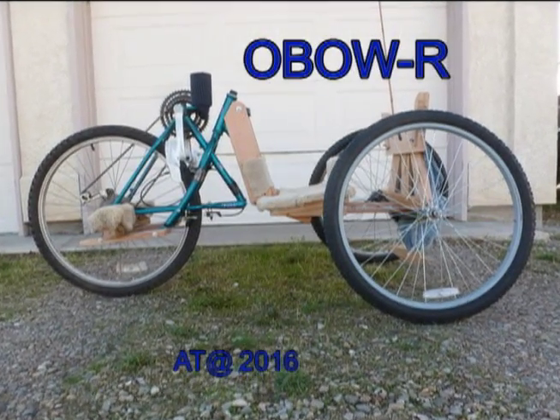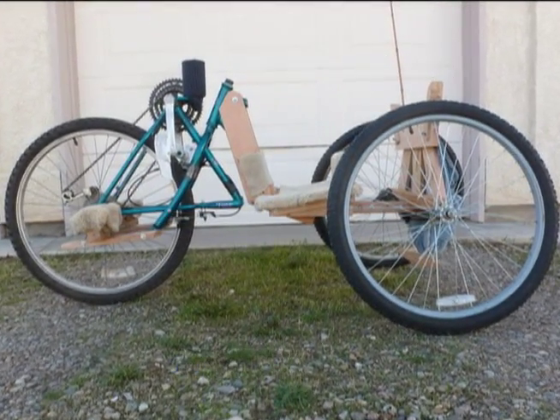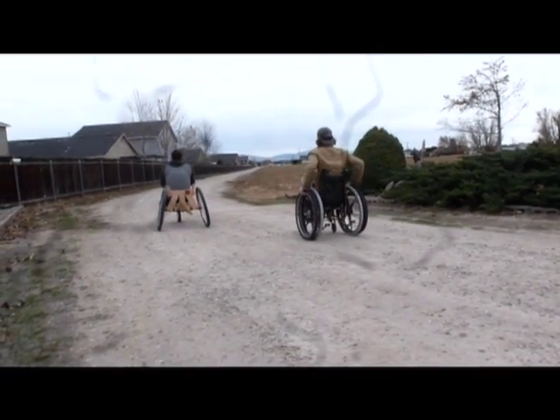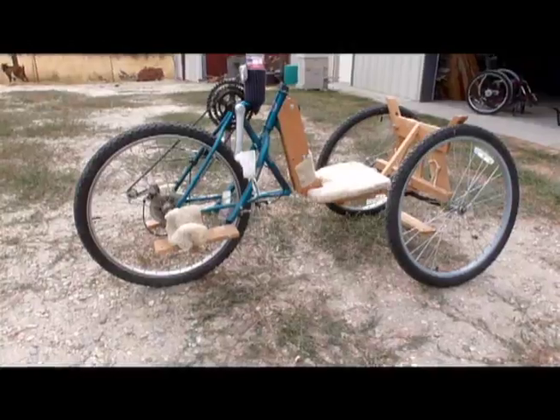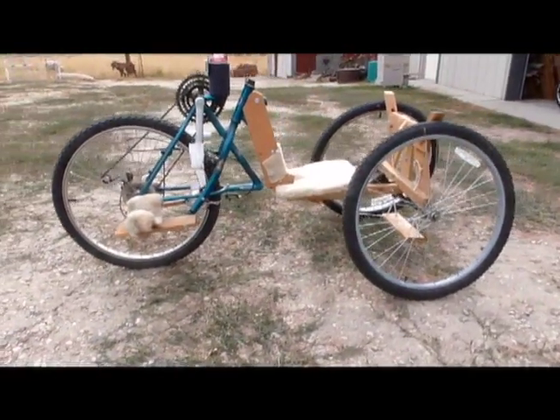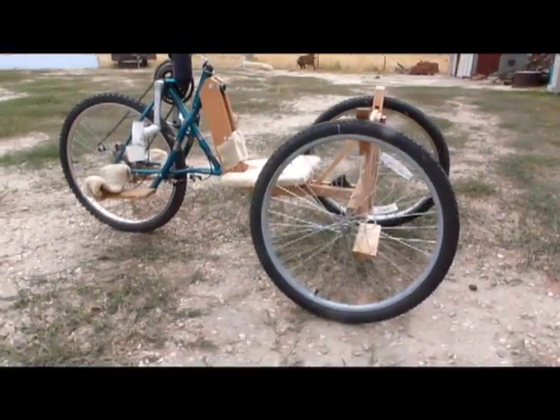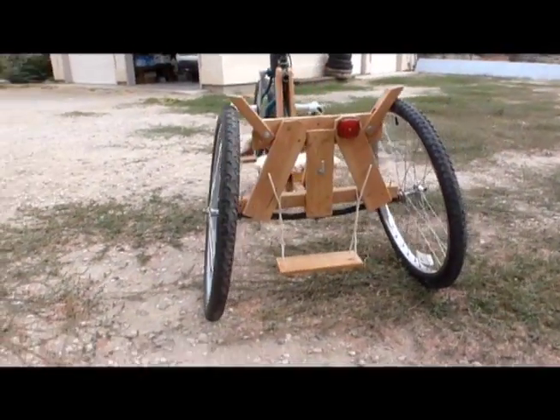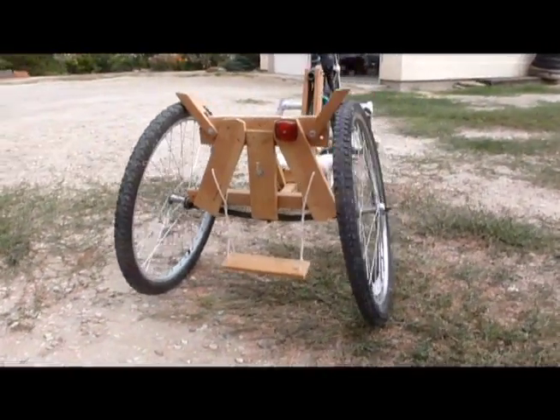Imagine racing off to town in your own customized ride that you and friends build in a few days for about the cost of a new bicycle anywhere in the world. The OBOW-R is a hand cycle designed to be constructed and maintained by the user and friends using local materials, tools, and skills.